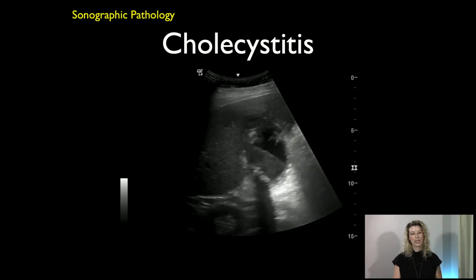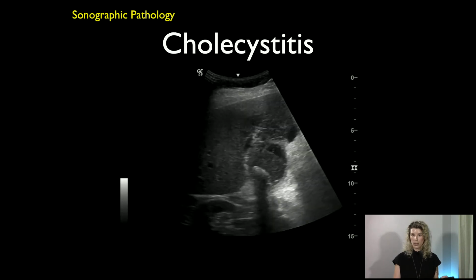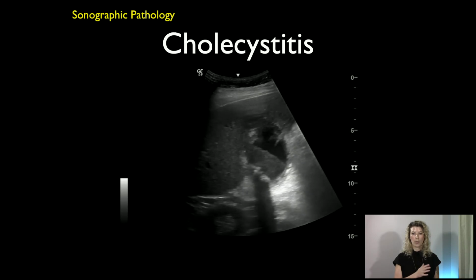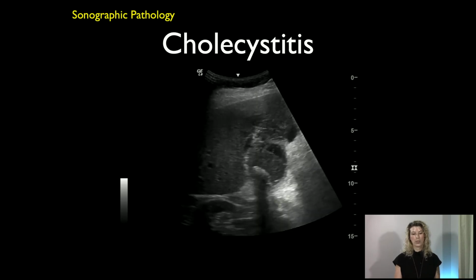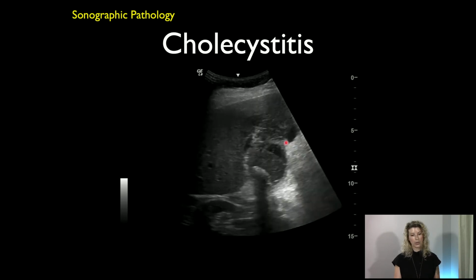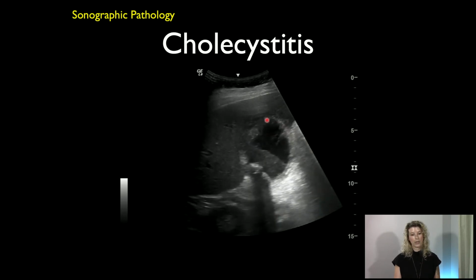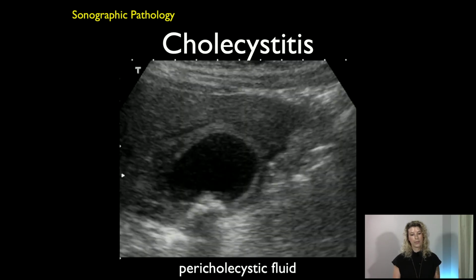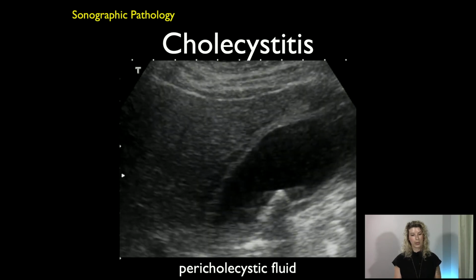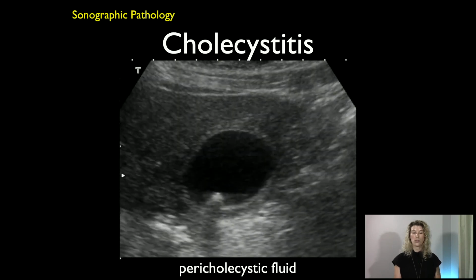This is a clip from the same patient that we saw some clips before. The clips we saw before were fanning all the way through the gallbladder in 2 different views, which you really need to do. But this clip is sort of an abbreviated clip because I really wanted to show the pericholecystic fluid here. Close up, pericholecystic fluid. You actually see 2 views in one in this one.